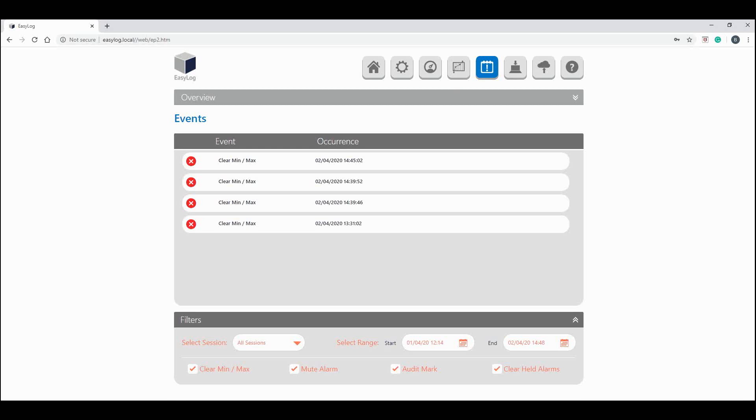At the bottom we can also check and uncheck any of these events if you do or don't want to see certain event types.